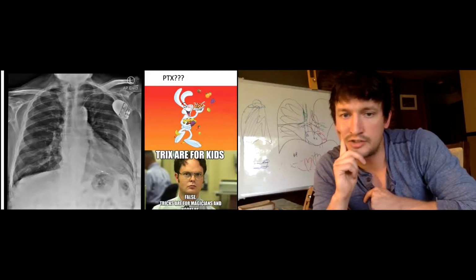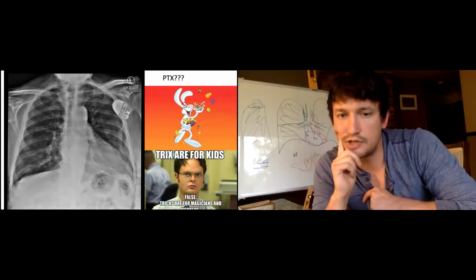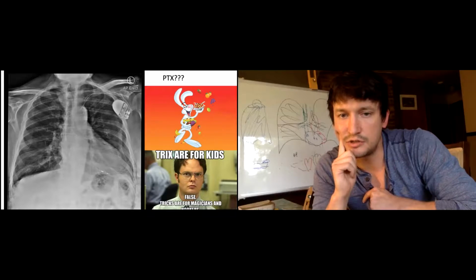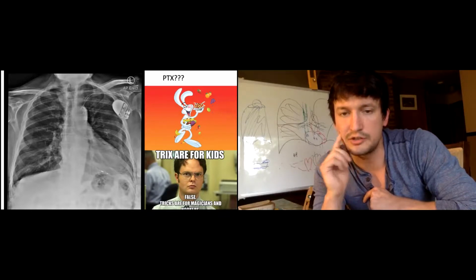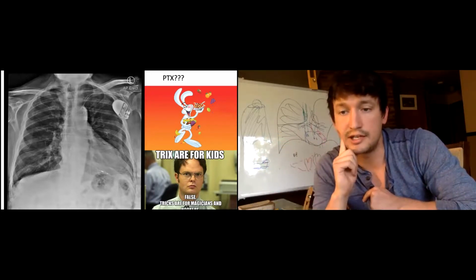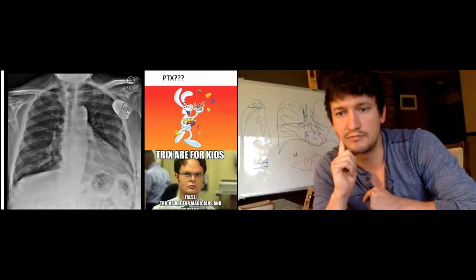On this one, you can see a line on the left lung which looks suspicious for pneumothorax, but if you notice, it's pretty thick and it actually goes across to the other side of the lung. That's actually just a skin fold. A lot of people can get tripped up on that. If you look really closely, we're not really able to zoom in on this, but there's actually lung vasculature that goes beyond that line, telling you that no, this isn't a pneumothorax. Next slide.